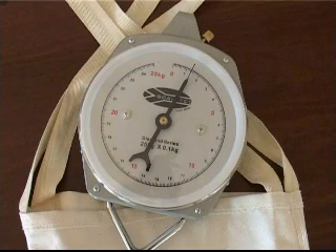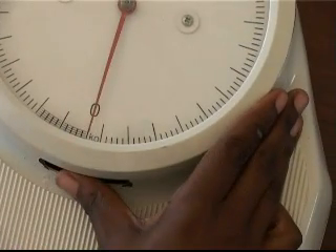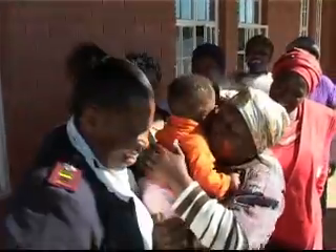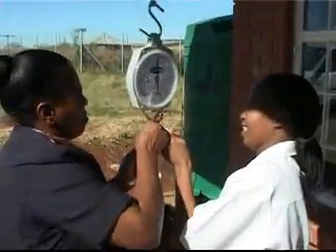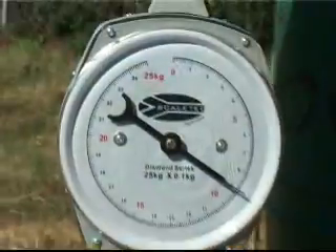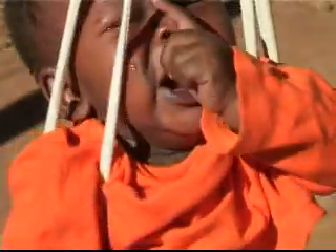The scale must be calibrated to zero before each use. With the trousers and sling fitted to the scale, turn the adjustment wheel until it reads zero. Observe the maximum weight and ensure that the infant or child is not too heavy for the scale. Lift the child carefully and safely into the trousers and take the reading. Alternatively, put the trousers on first, then hook the sling to the scale to take the reading.